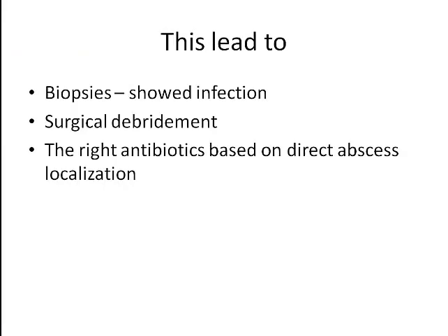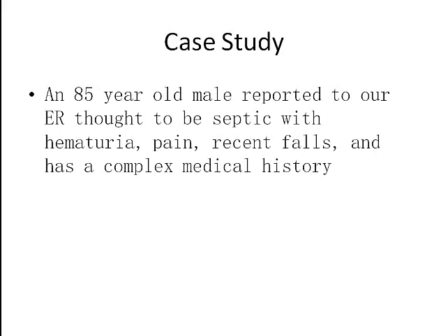So it's easy to biopsy. A simple punch biopsy showed the type of infection he had and allowed you to pick a specific antibiotic. This is very similar to chemotherapy. Now you're able to pick, based on what you need, the antibiotic that will allow you to direct treatment. So let me show you another example.